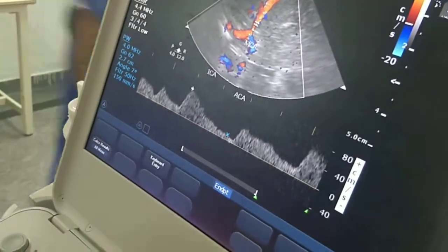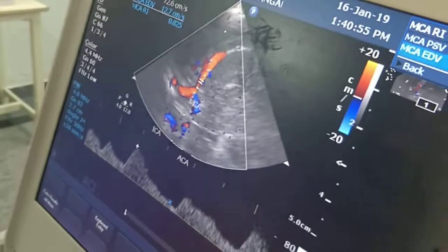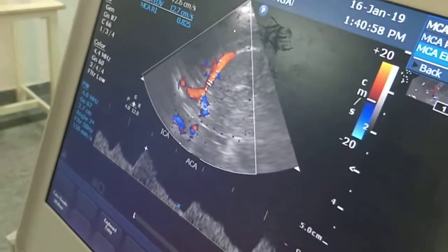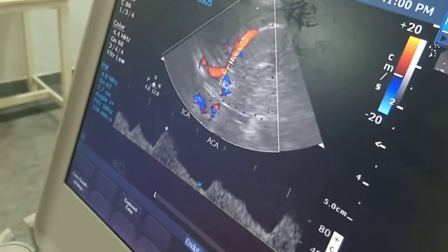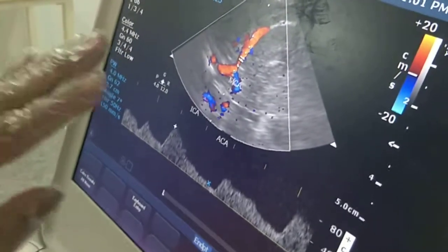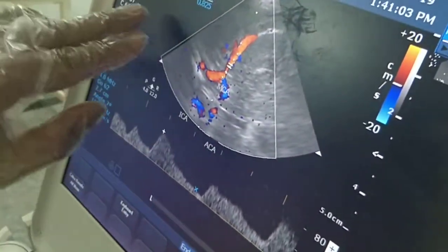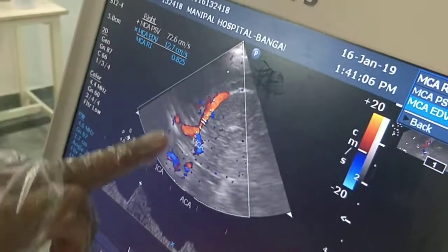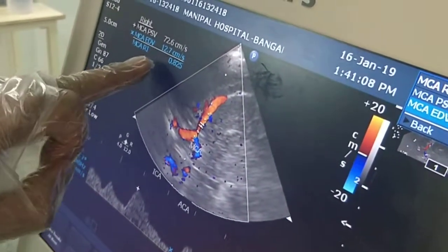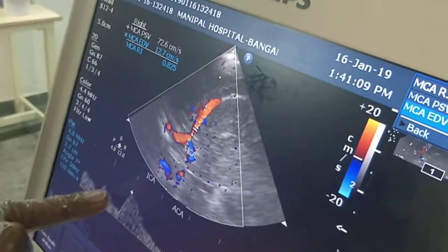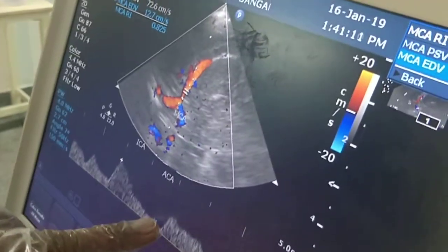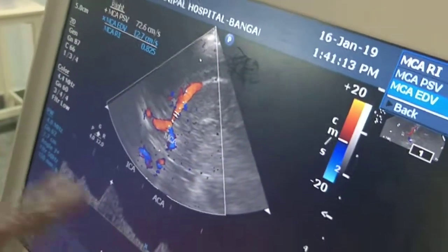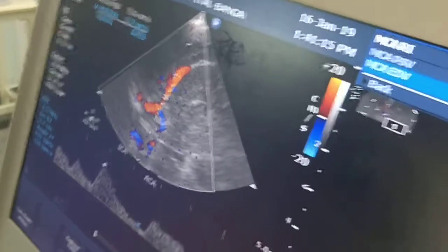You can look at the MCA — this MCA value is 0.825. This is the peak systolic velocity, end-diastolic velocity, and the resistive index of the middle cerebral artery is 0.825, which is normal.